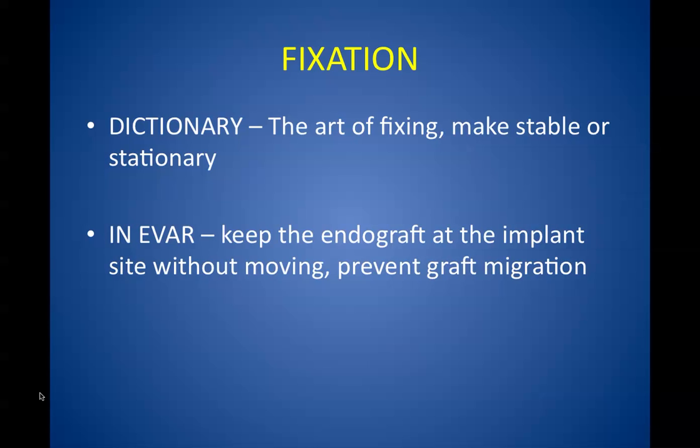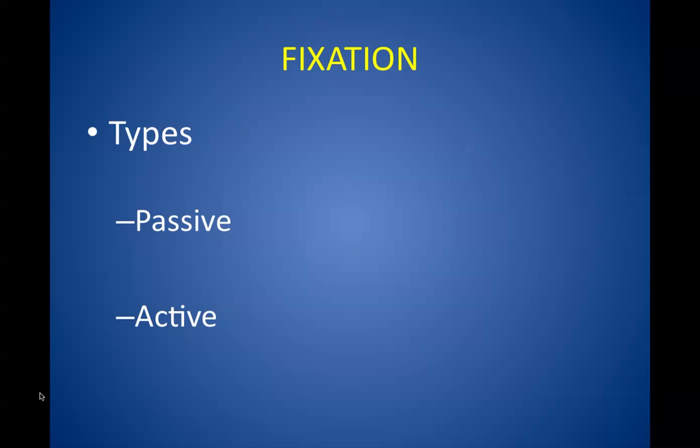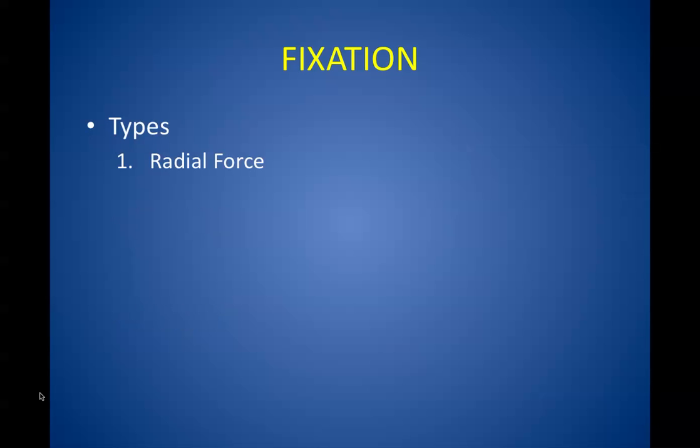So first of all, what is fixation? Well, for all of us out there, it's not really the dictionary definition. It's we don't want our endograft to migrate. What are the types? Well, there's really two types, passive and active fixation.